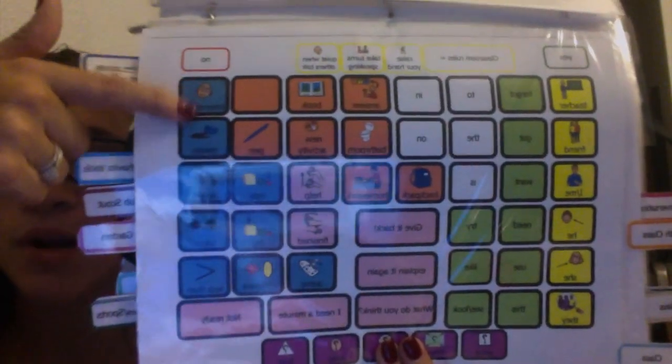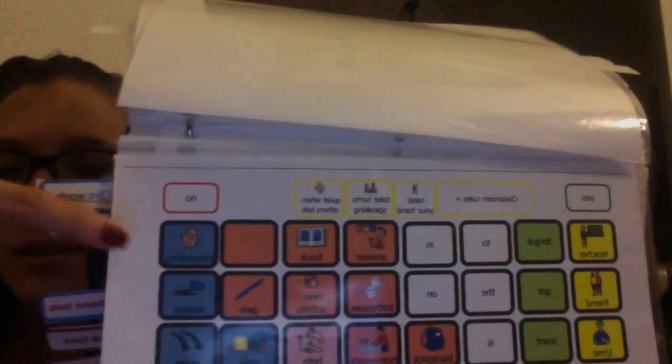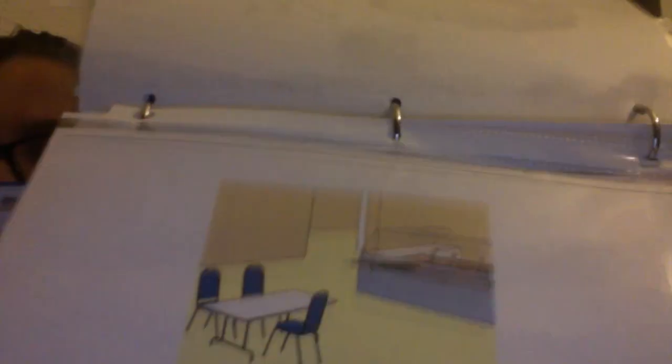And I also created other things related to vocabulary that you could use in the classroom, such as big, little, same, less than, messy. And again, yes and no, for quick and easy access. And since these icons are so separated from each other, I made the thickness on them a little less than the ones over here. And then this one is an empty one, just in case he's in class and a new vocabulary word comes up, they can easily just write it in there for Brandon.